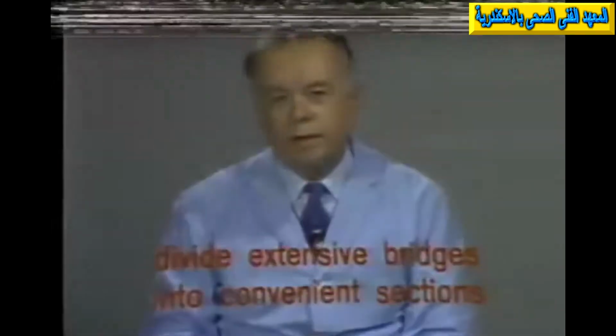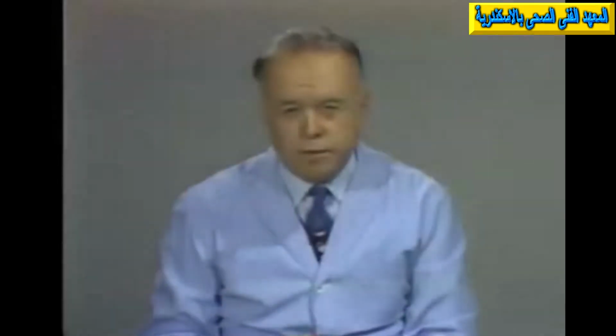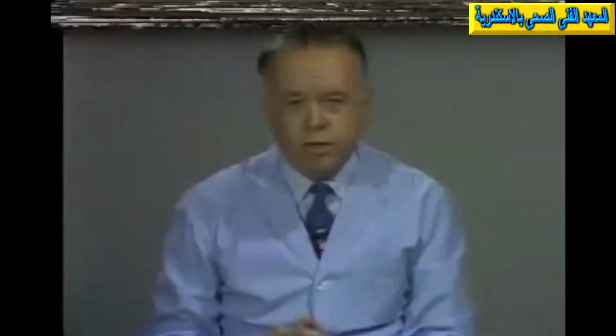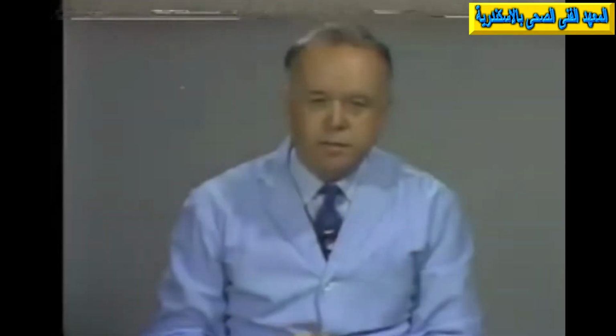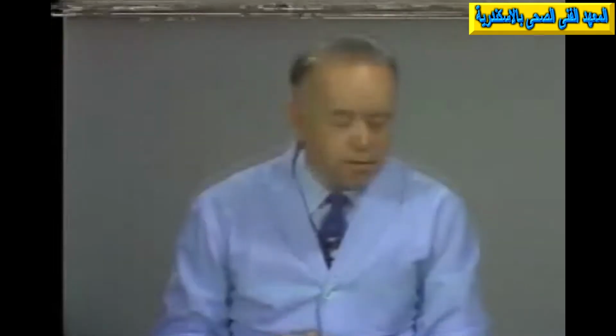And the third use is to divide extensive bridges into convenient sections. If you're building a bridge which is going to perhaps go all around the maxillary arch, it may be convenient to build a bridge which can be cemented in a series of sections which interlock with each other. It has advantages at the time of preparation and aligning abutments. It has advantages in the time of cementation, of handling smaller sections. It has advantages in maintenance. If one part of a bridge develops problems, it can be removed independently of the rest, and the problems corrected and then reinserted without disturbing the whole prosthesis.